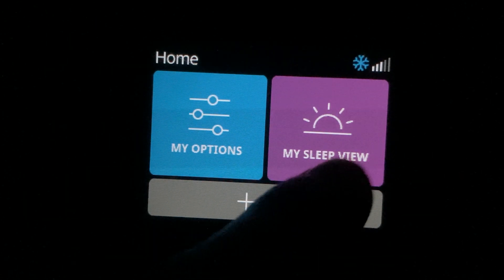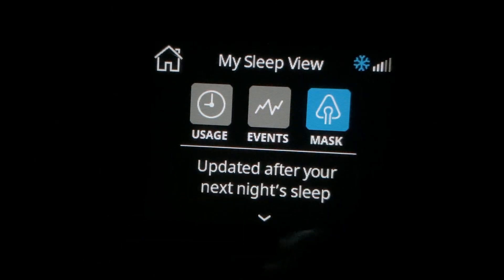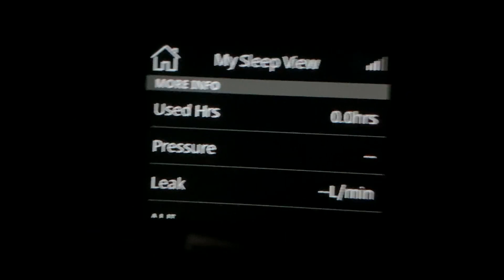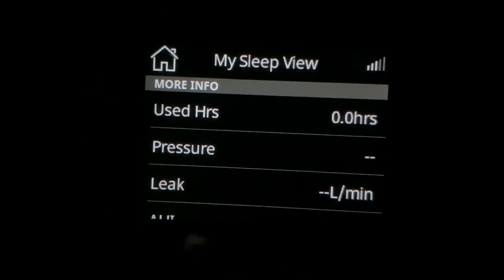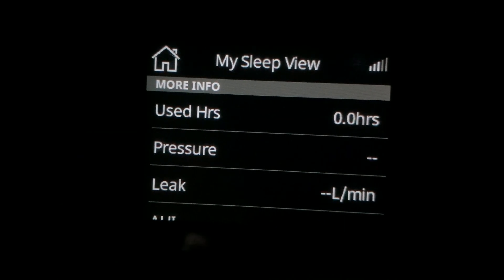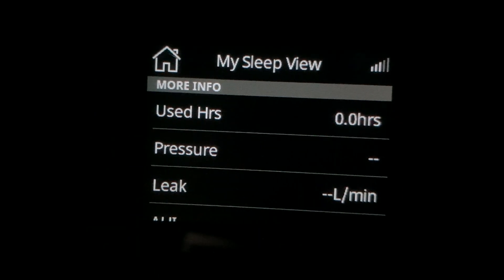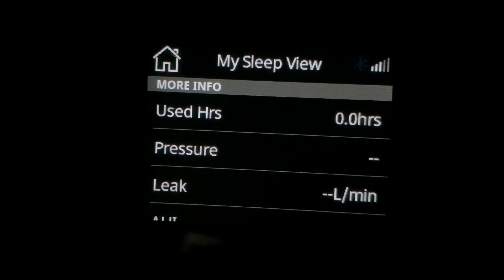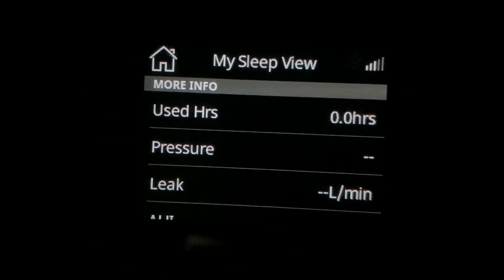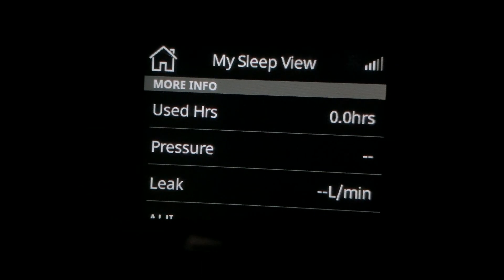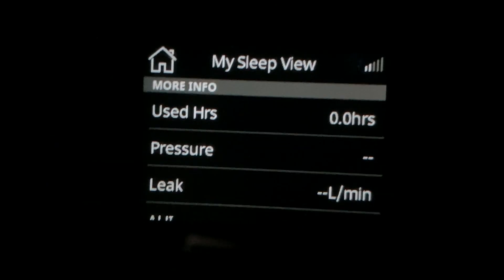If you want to know how you did with your leak, you will go into My Sleep View, then mask, and scroll down until you see the leak number, hoping that you can keep your leak below 24. If you're not able to, have a discussion with your medical supply company or the person that ordered your machine to see if there are some strategies to help reduce that number. If you don't have a mask covering your mouth, a chin strap can help — and sometimes a chin strap can even help if you have a mask covering the mouth, if you're moving your jaw a lot it might help keep that jaw more in place. Make sure that any leaks you're hearing you try to resolve the best you can.